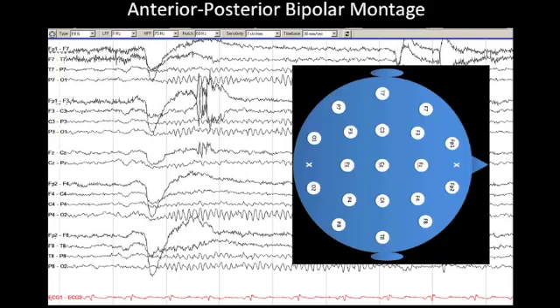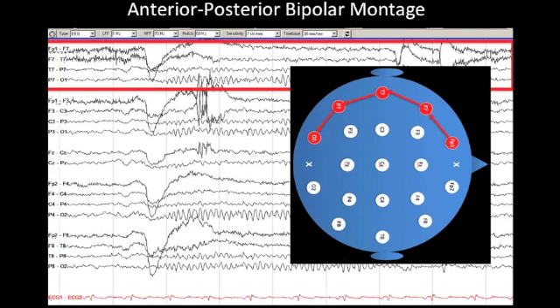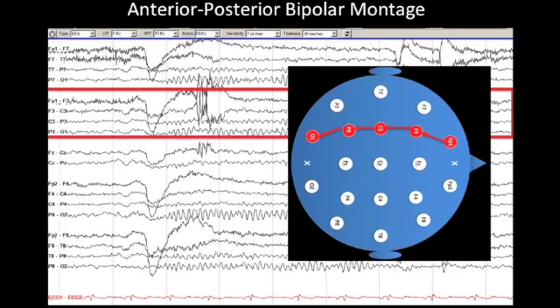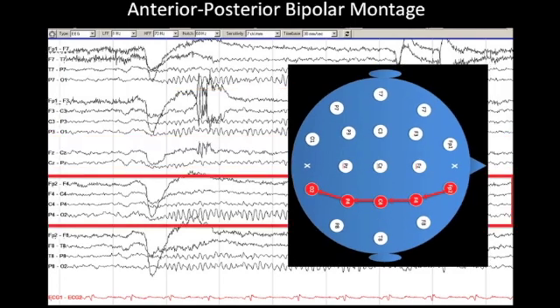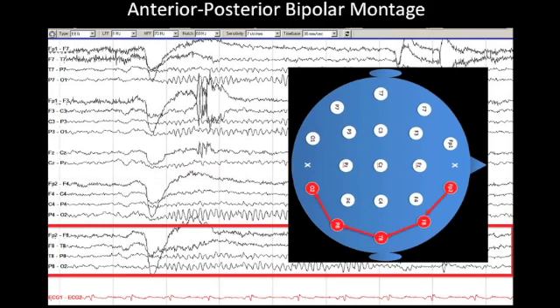Going through this systematically, we can see that this particular montage is arranged as if we are looking at the top of the patient's head while they are facing rightward. First, we have the left temporal chain, then the left parasagittal chain, then a midline chain in the middle, then a right parasagittal chain, and finally a right temporal chain. In general, left hemisphere electrodes are shown on top of right hemisphere electrodes.